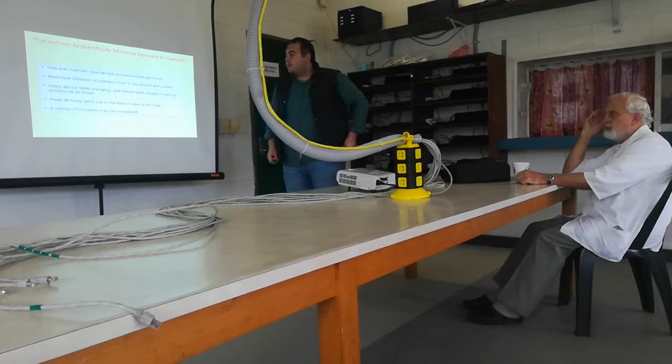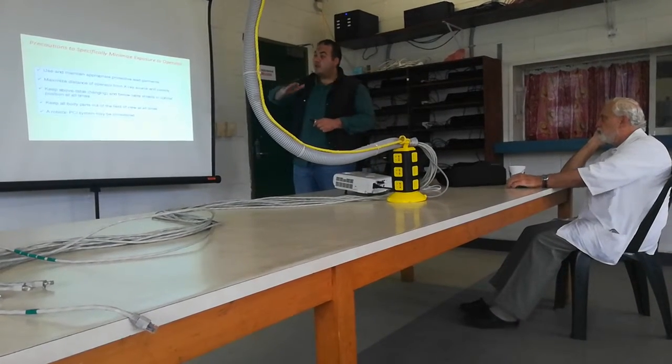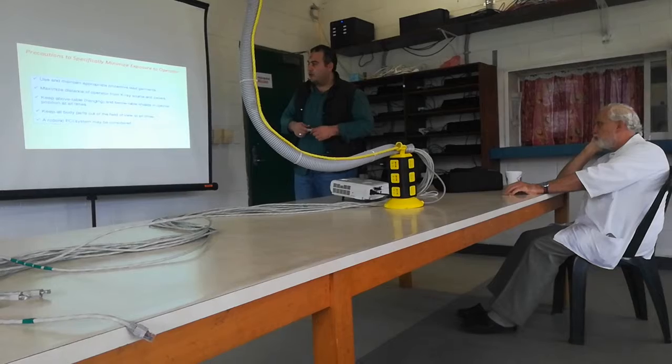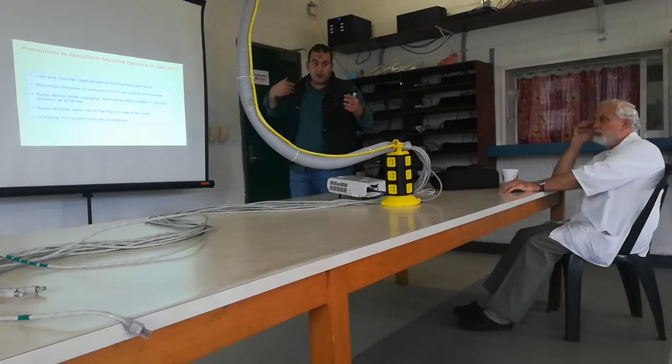Use and maintain appropriate protective lead garments. Maximize distance of operator from X-ray source and patient. Keep above table and below table shields in optimal position at all times. Keep all body parts out of the field of view at all times, all body parts of patient.